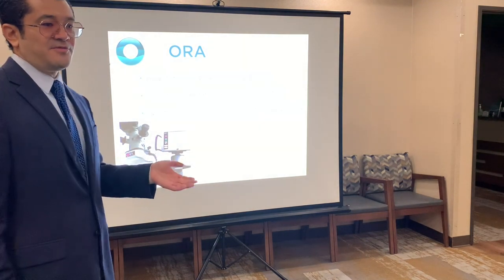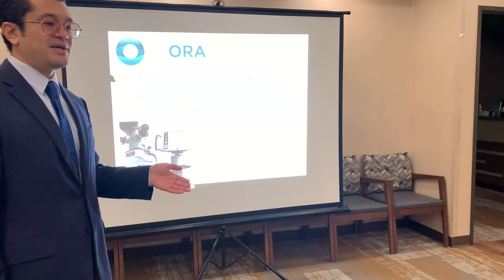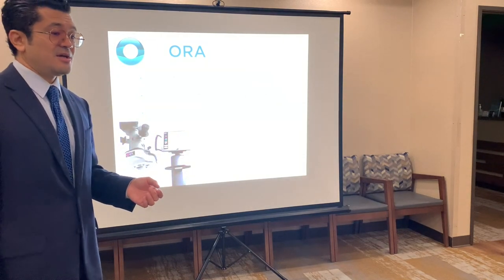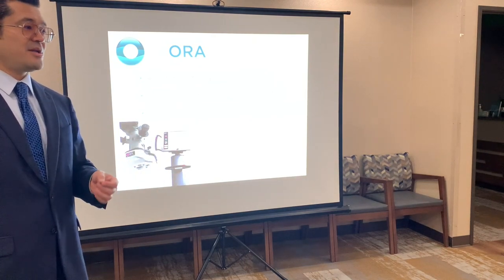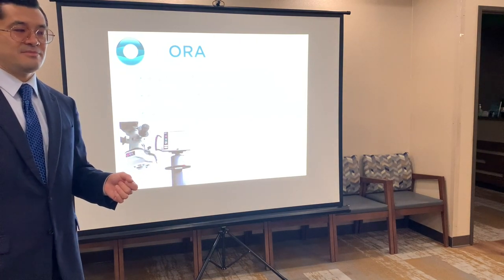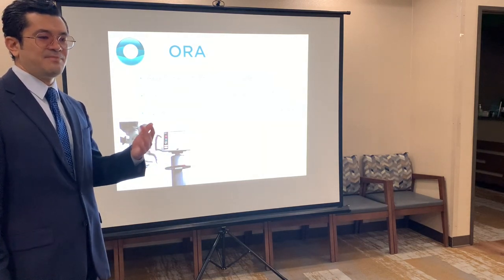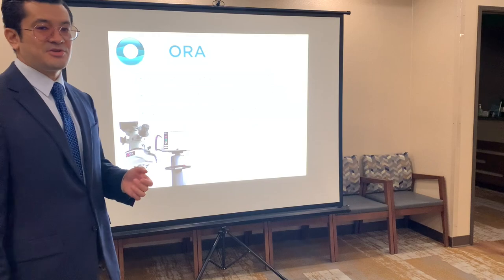And then every few months, it has an update. So based on our outcomes, it's going to update our surgeon factor. So every year that goes by, we're getting more and more refined outcomes because of this learning curve, it's empirically giving us better data as the years go on.